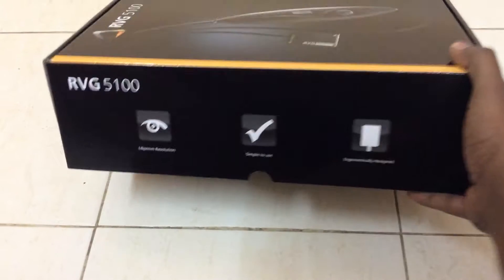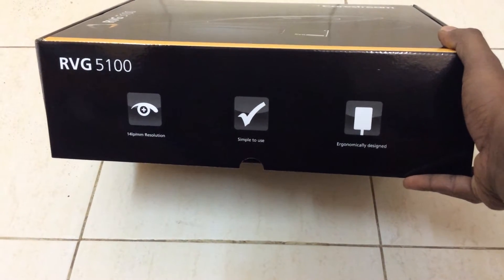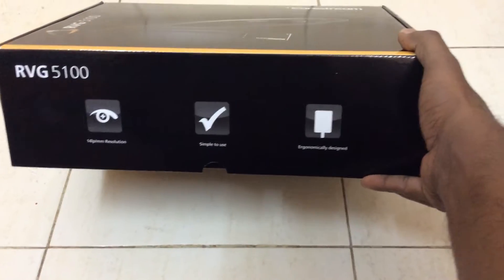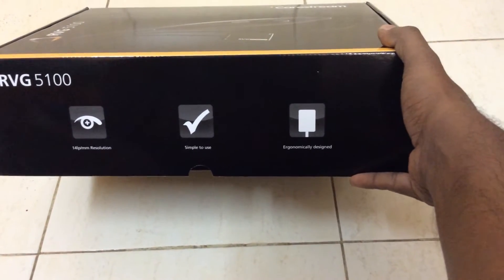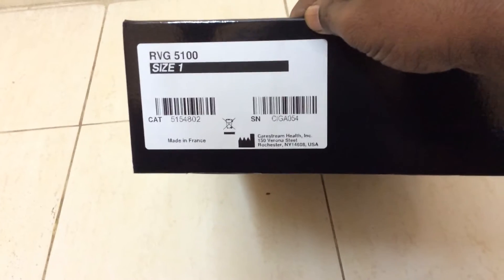We have the box which is a solid build. You can check its 14 LP per millimeter resolution — simple to use, ergonomically designed. You can see the website address. Here you can check the warranty, serial number, and it's size 1.